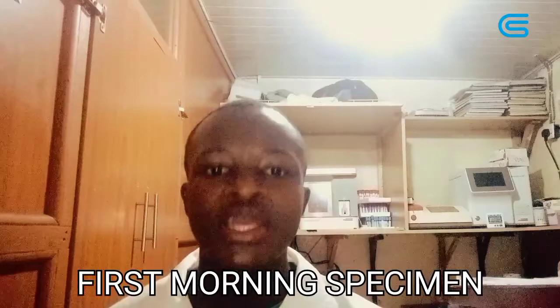I will briefly speak of the types of specimens that we collect for urine. So number one, we have the first morning specimen. This is a specimen obtained during the first urination of the day. So when you wake up in the morning, it's majorly good for nitrite and protein analysis and microscopic examination also.